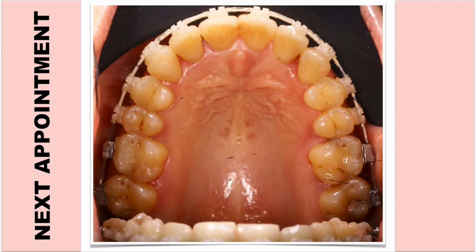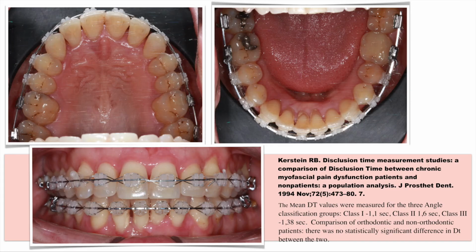At the next appointment she came in, everything was healthy looking and pinkish, and of course we removed the occlusal buildups. This made us recognize and understand that the problem was actually an occlusal problem contributing to the periodontal involvement and periodontal abscess that took place in this patient.